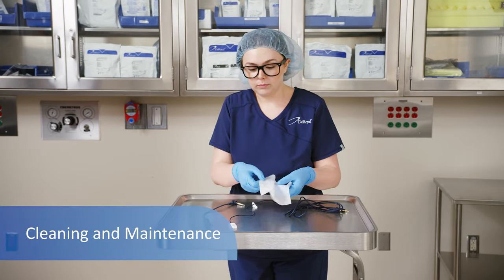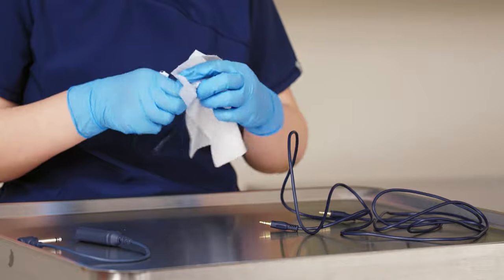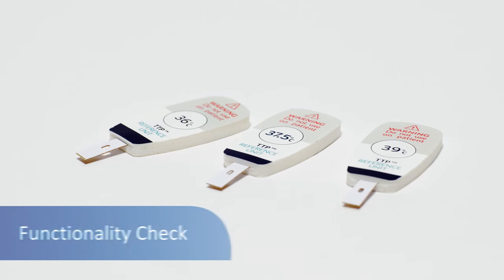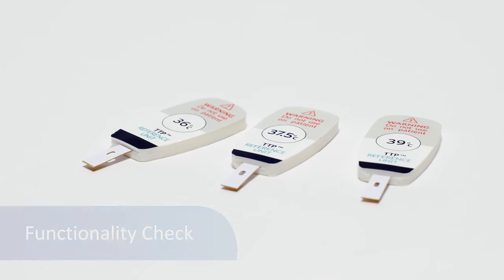Clean the connecting cable between each use by wiping down the entire cable with a damp, soft fabric and 70% isopropyl alcohol, and allow to dry. The MCU accuracy is required to be checked once every two years with Temple Touch Pro reference units; instructions are included in the reference unit kit.